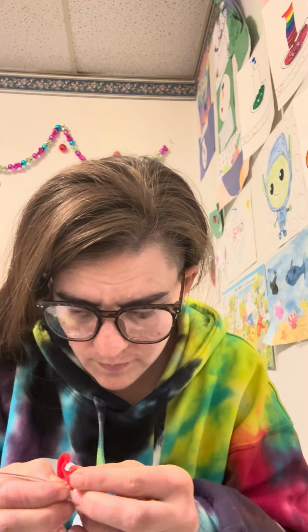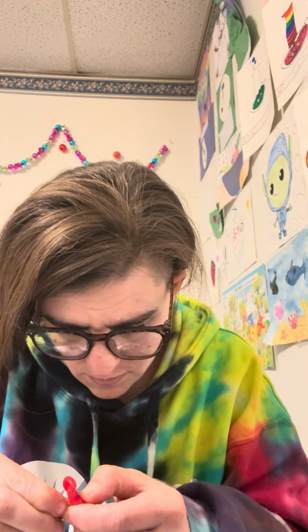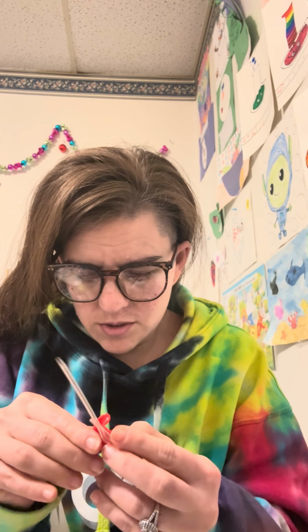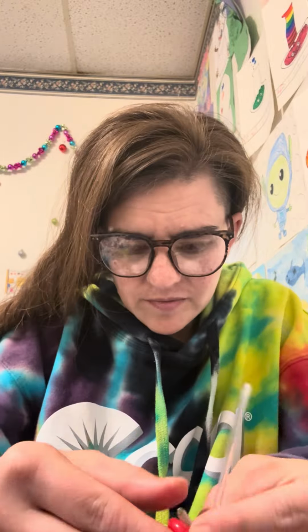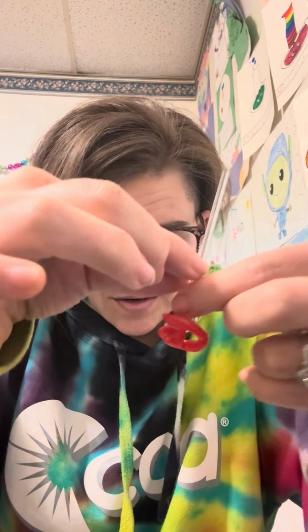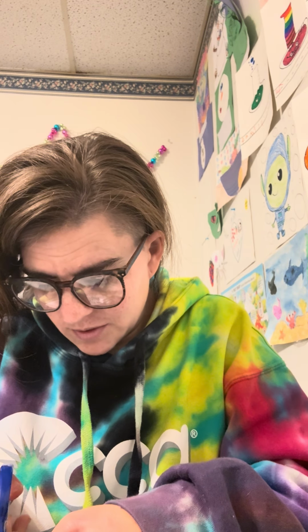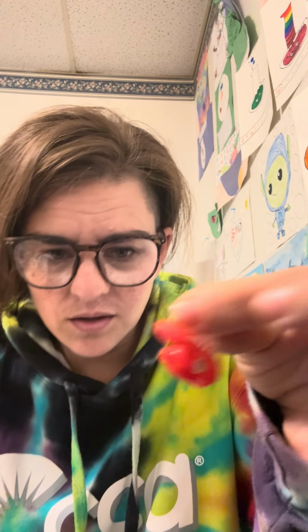I'm lining it up. So here it is. Lining it up. And then I'm going to cut it. See, I lined it up to where it needs to be on the mold. Let me face it the other direction. So I lined it up like this, and then I'm going to cut it a little bit longer than I need. Let me show you how much longer I cut it, because it does shrink when it gets colder. So see, I cut it longer.